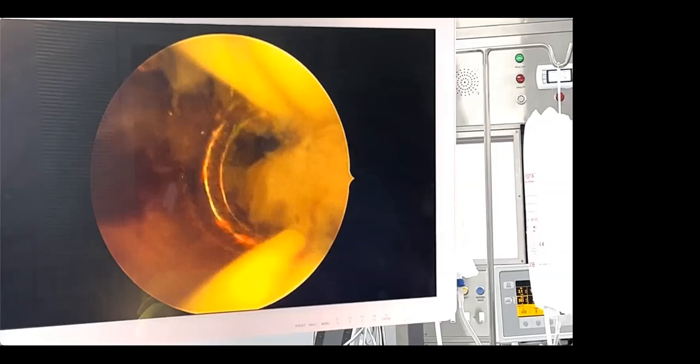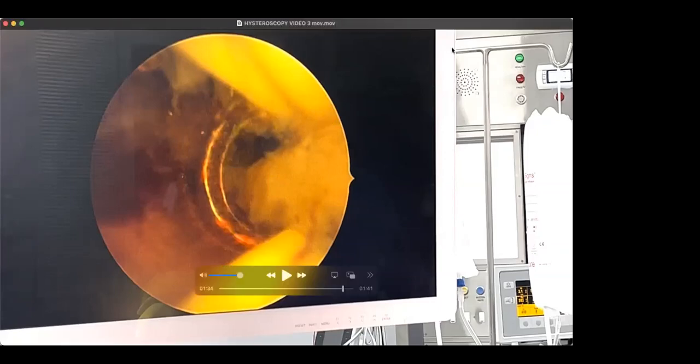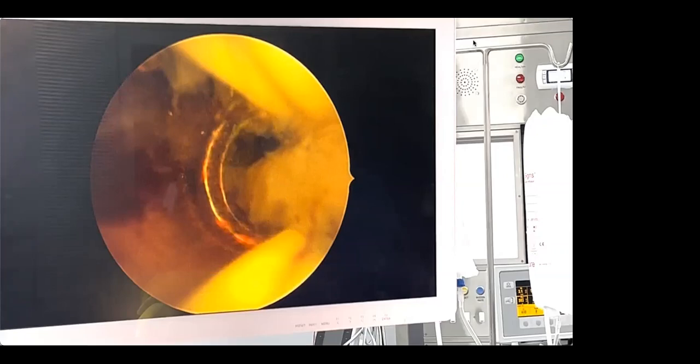Dr. Zeki, maybe yes, we can have contributions from Dr. Chuang and Dr. Shava, because I'm assuming that they do more cases of hysteroscopy. How do they manage their fluid deficit, or do the fluid management? Maybe Dr. Chuang and Dr. Shava.